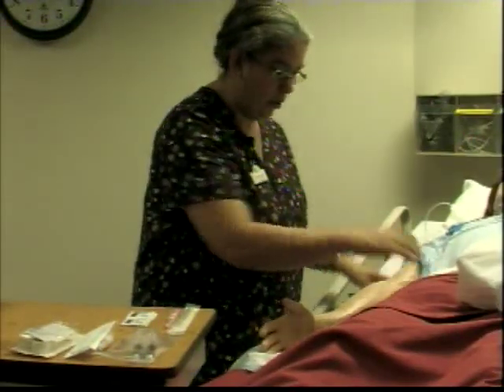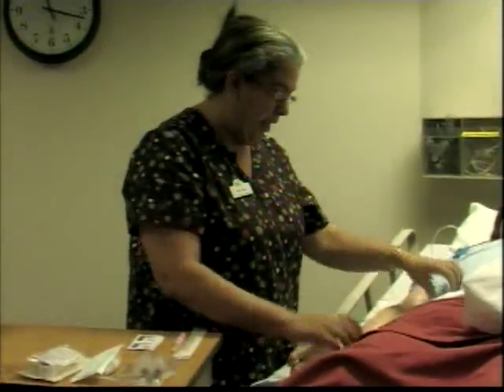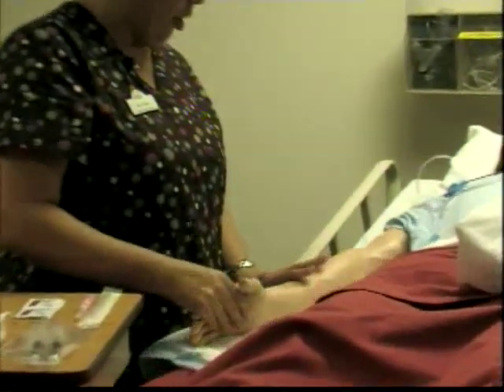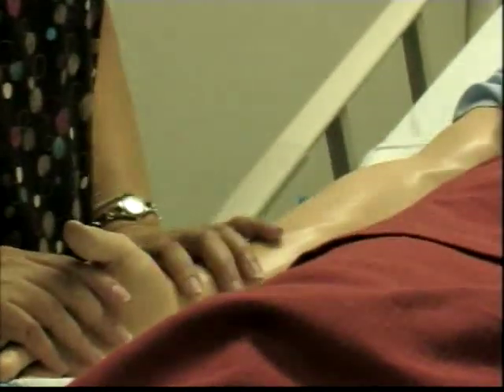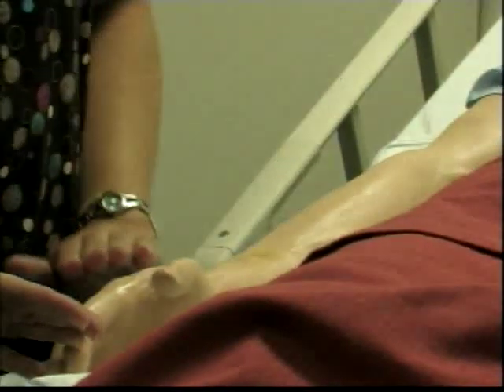I already have checked all that medical history from before. I have looked and made sure that I'm using an extremity that is able to do so. So the first thing I'm going to do is look into my extremity. I'm going to look for any bruising, any scars, any swelling or anything like that that will prevent me from performing a needle stick.